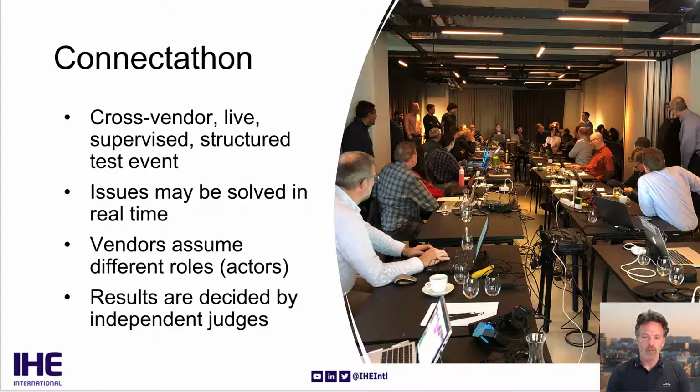To see if the profiles are working, and to be able to show everyone what the vendors can do and what users can expect, these Connectathons are organized by IHE-RO, and they are cross-vendor, live, supervised, structured test events. A lot of vendors participate. There's a picture there from one of the more recent ones, which was a physical meeting in Stockholm. This picture was actually taken by me right after welcoming everybody to the event.